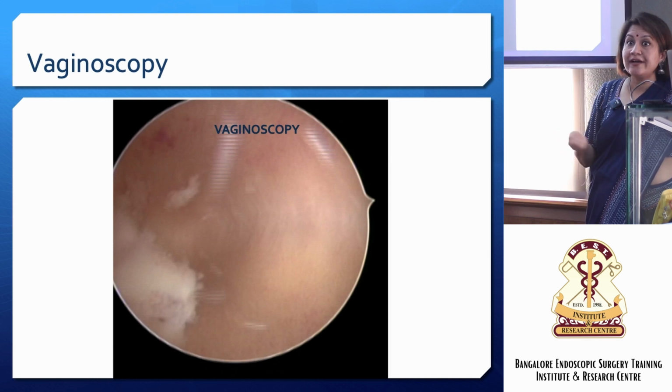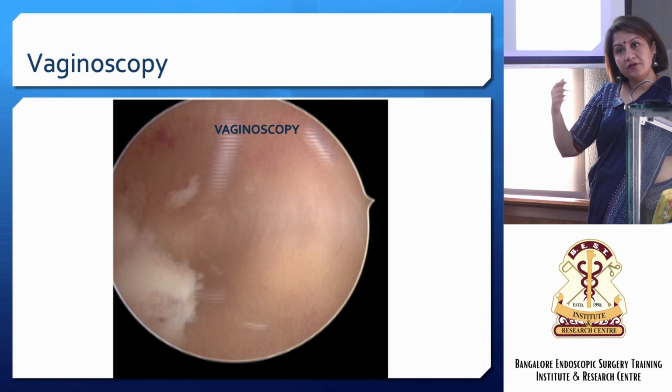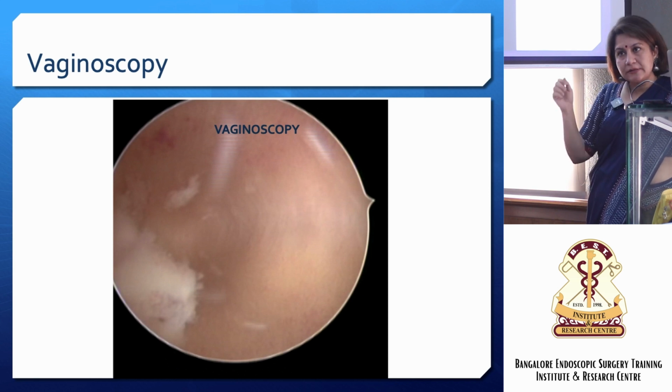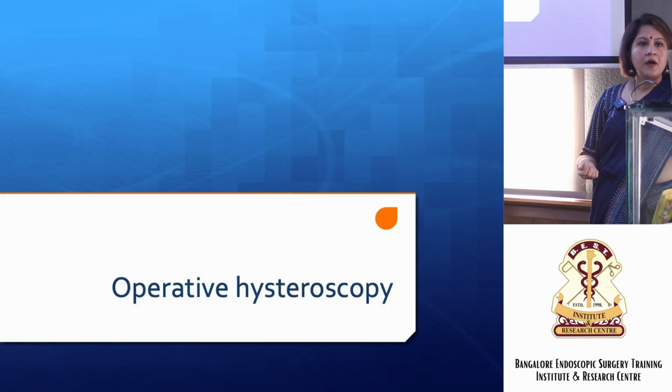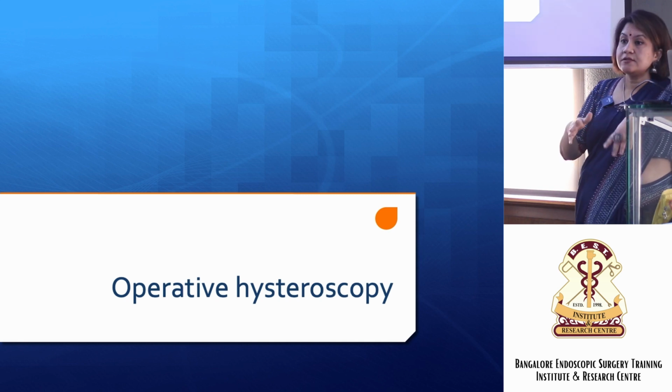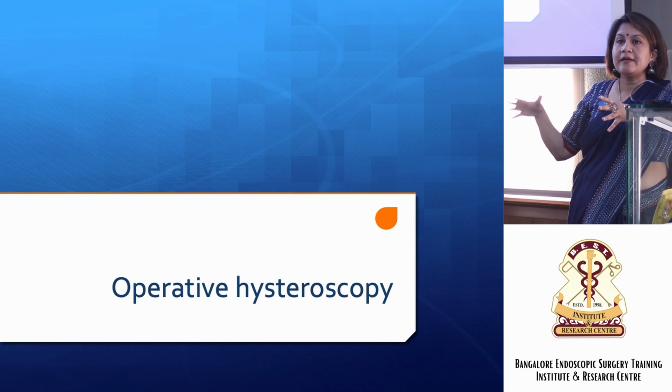So we also need to get a hang of these. It's better to do it when the patient is under anesthesia, routinely, after we get the hang of doing hysteroscopies. Get into the habit of doing vaginoscopy also. At maximum, if you can't enter, you can always go back to your old technique, but just get into the habit of doing this.